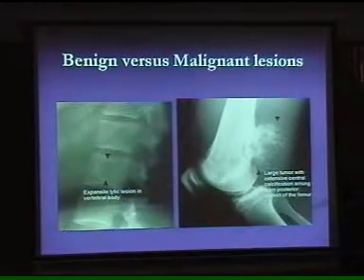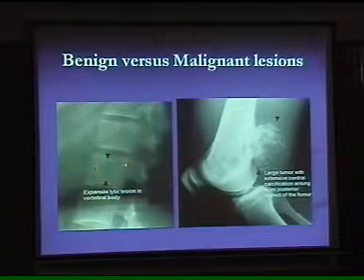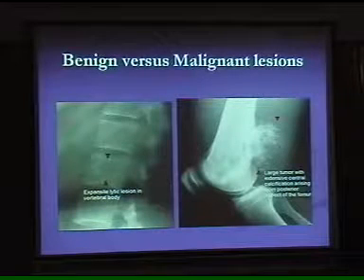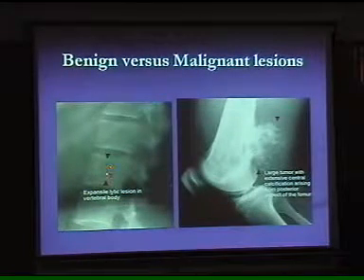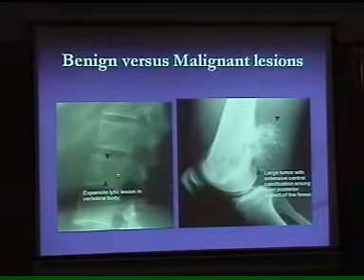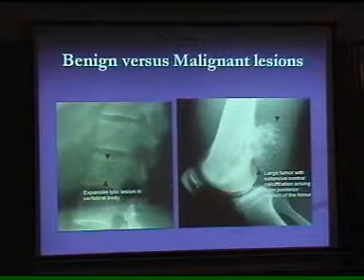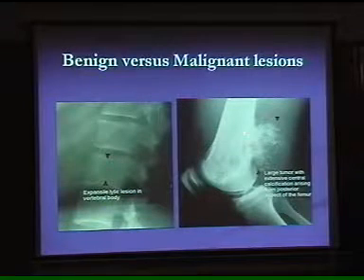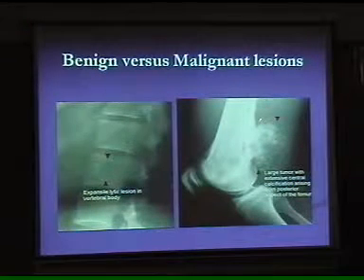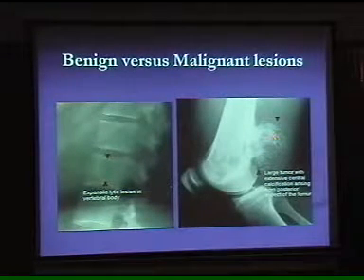Look at this one slide between the benign and the malignant growth. If you look at the spine, there is a well-defined, smooth-outlined lucent area in the vertebral body. There is a dense line behind that, which again indicates a reparative process. That means it is not allowing this disease entity to grow aggressively. The demarcation between the normal and the abnormal bone is a very thin line, and there is no break in the outline. On the contrary, if you look at this X-ray, there is the lower end of the femur, the knee joint, and the patella. If you look at the cortex, the cortex is broken up. There is an abnormal, irregular, heterogeneous, dense shadow with break of the cortex, and the disease has permeated easily. And look at the soft tissues, it's extending into the soft tissues. They all look like bone, but basically these are not calcifications.